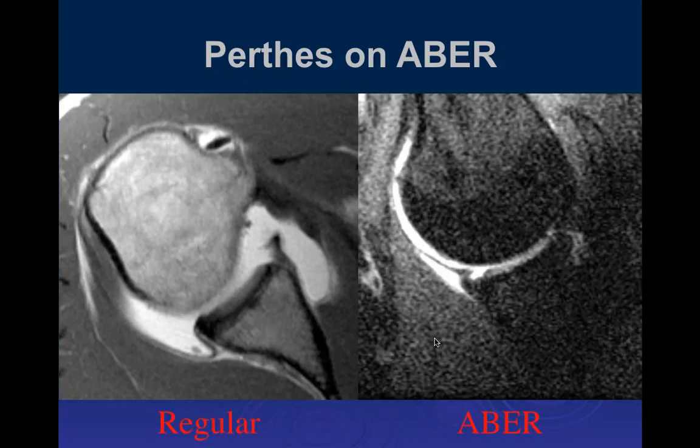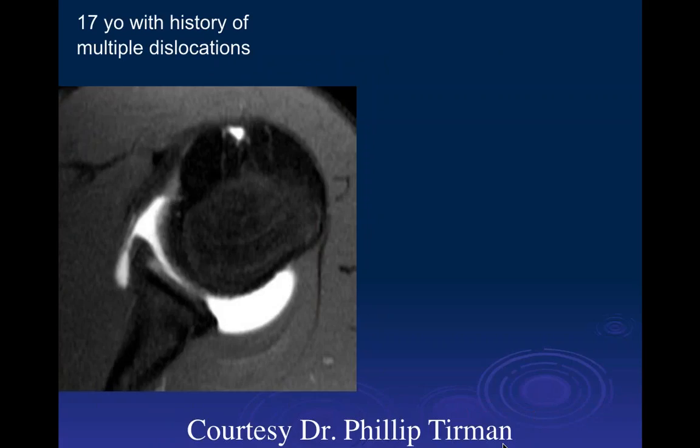All right. Well, it's called an ABER view, even though I understand, John, but if it was me, I would call it hyperflexion view with external rotation. Because nobody with a sore shoulder can do this, I can assure you. Fair enough. So the motion as represented is straight abduction, and they just cannot do that.